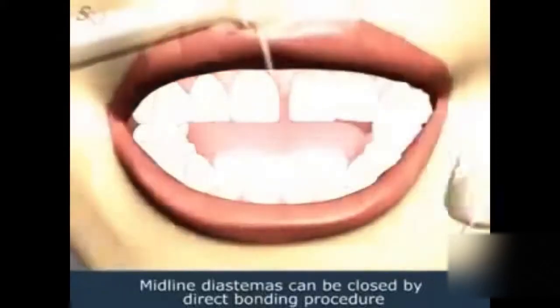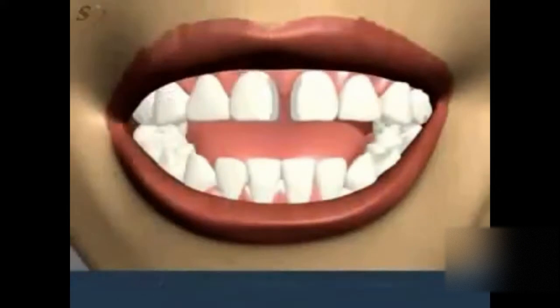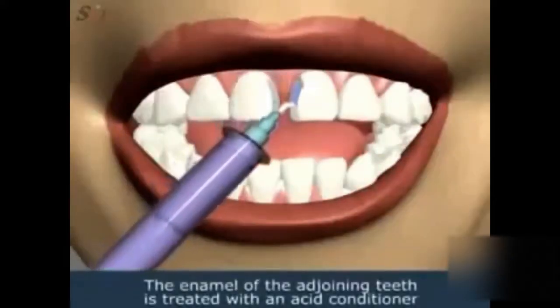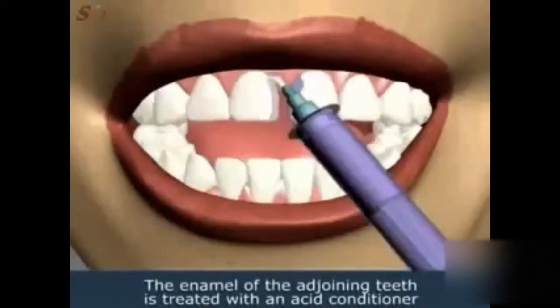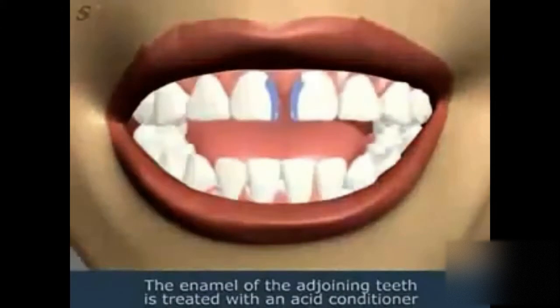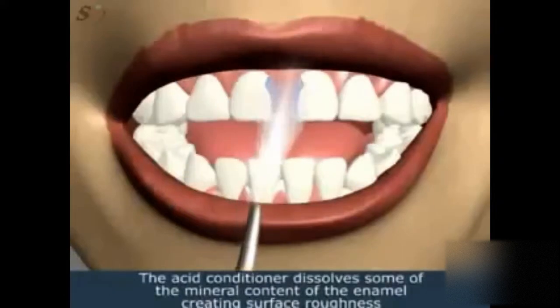The diastema can be closed by a direct bonding procedure. The enamel of the adjoining teeth is treated with an acid conditioner to help the bonding material adhere to their surfaces. The acid conditioner dissolves some of the mineral content of the enamel, creating surface roughness.